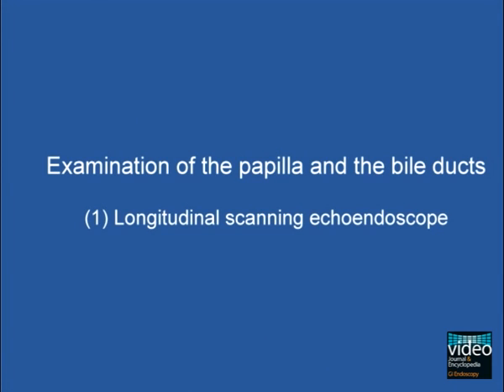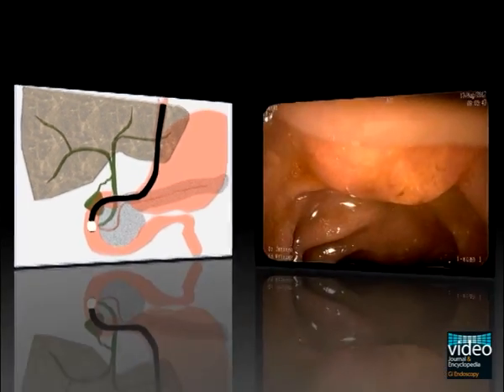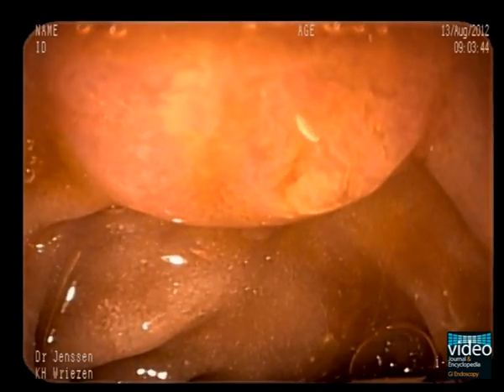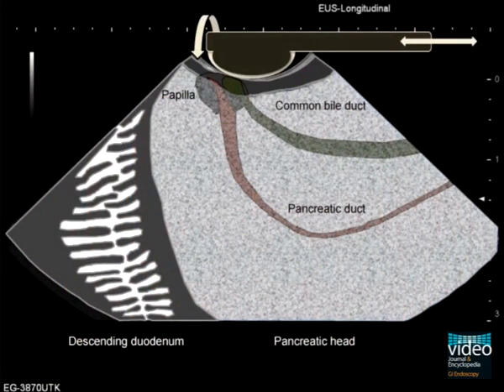Longitudinal EUS of the biliary tract starts in the second part of the duodenum. Having straightened the echoendoscope as usual in endoscopic retrograde cholangiopancreatography (ERCP), close contact is established between the transducer and the papilla. The scope is withdrawn very slowly until the hypoechoic triangular papilla is visualized. In most cases, the pancreatic duct will appear first.